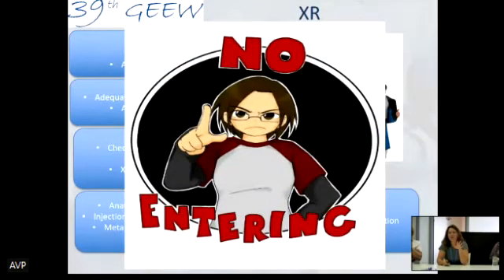So we try to keep the door closed when we use X-ray, but it never works in our department. Everybody comes in and out, but it's very important to keep the door closed. And in Cluj-Napoca, the X-ray stops if you open the door. It's a good way to prevent that.